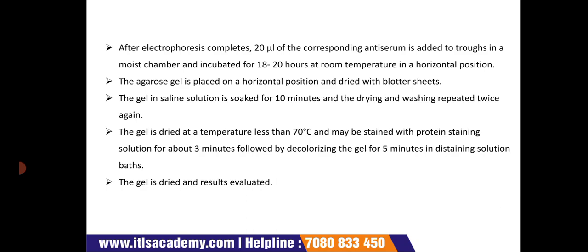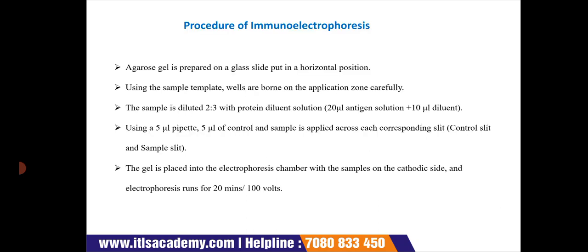Then comes the gel placed in the electrophoresis chamber. For how many minutes is it placed in the electrophoresis chamber? For 20 minutes. And what is the current? That is 100 volts. So these things should be kept in mind while understanding the procedure of immunoelectrophoresis.